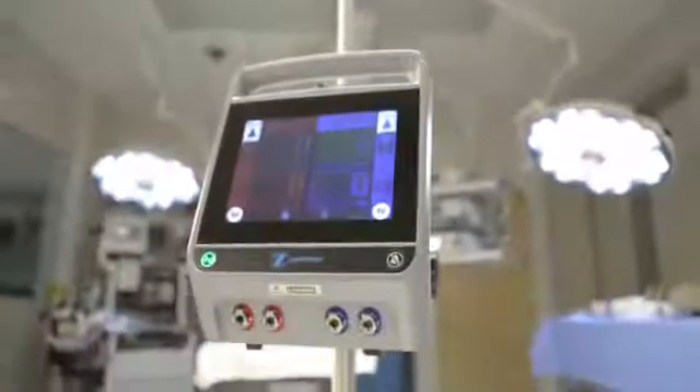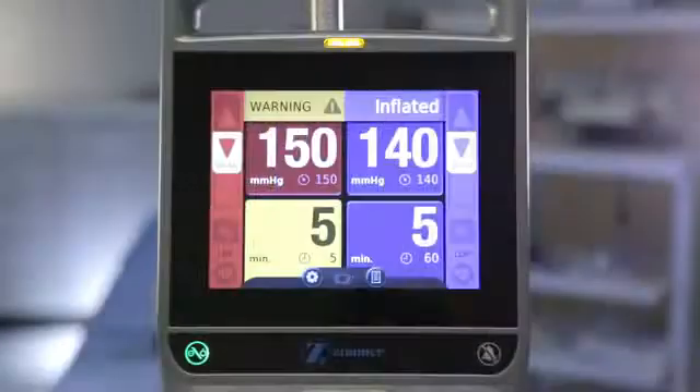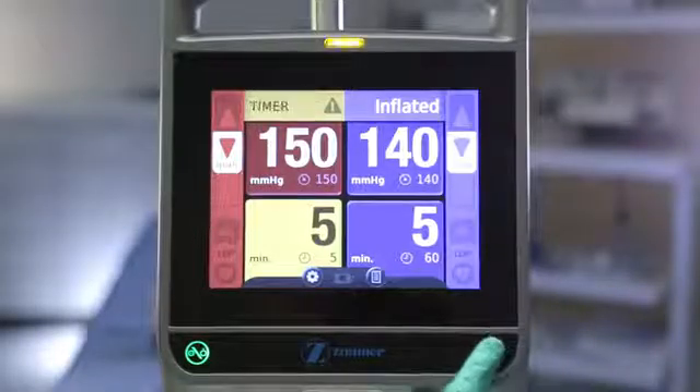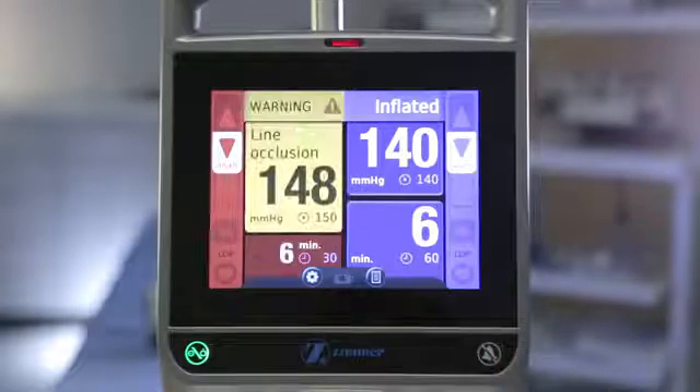The ATS 4000 recognizes two types of errors that may occur. For a minor error, such as time expiring, the indicator light will flash yellow and a message will appear on the screen. This type of error can be silenced for 30 seconds by pressing the alarm silence button. For a major error, such as a line occlusion, the indicator light will flash red and a message will appear on the screen. This alarm cannot be silenced until the issue is resolved.